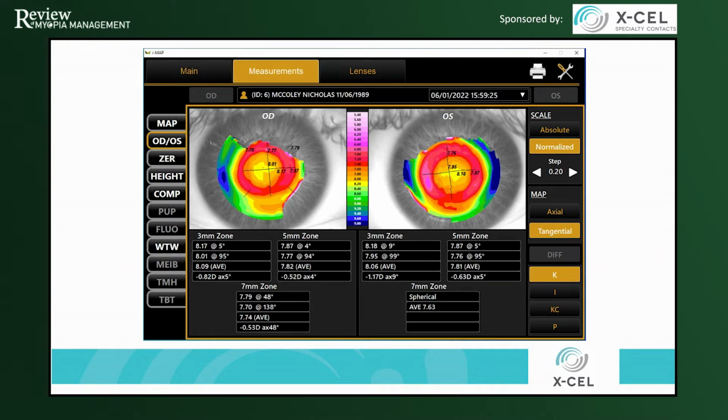So this is when I started working with REMLens. With REMLens, I'll let Tony discuss the design of it and where we went, but I basically presented Tony with this problem and I said, how can you help me? So Tony: 2 things that I would like to point out with REMLens and the development of it that took several years, was we needed to look at the older designs, and maybe not antiquated, but older, that were developed for straight ortho-k.